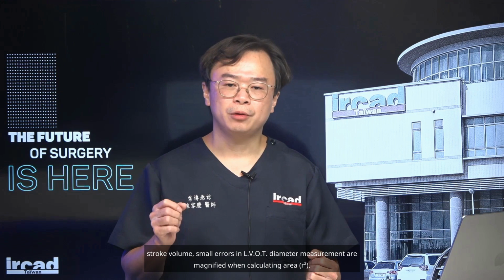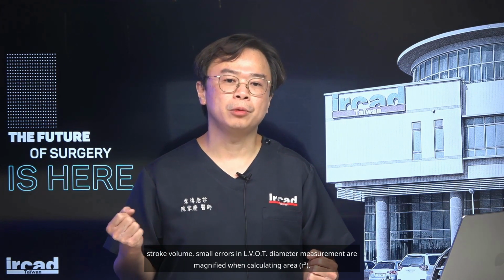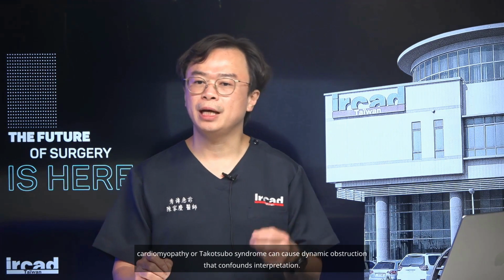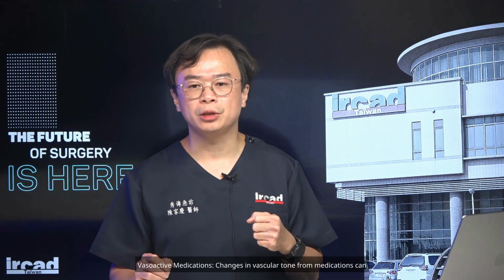If calculating absolute stroke volume, small errors in LVOT diameter measurement are magnified when calculating area, πr². 6. Dynamic LVOT obstruction. Conditions like hypertrophic cardiomyopathy or Takotsubo syndrome can cause dynamic obstruction that confounds interpretation. 7. Vasoactive medications. Changes in vascular tone from medications can alter the relationship between LVOT VTI and effective tissue perfusion.